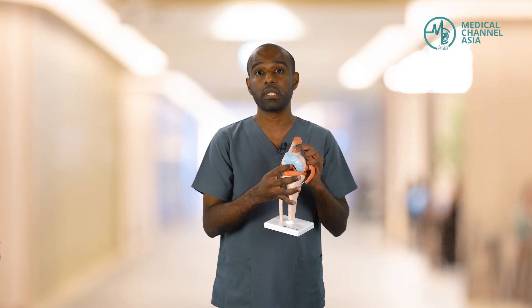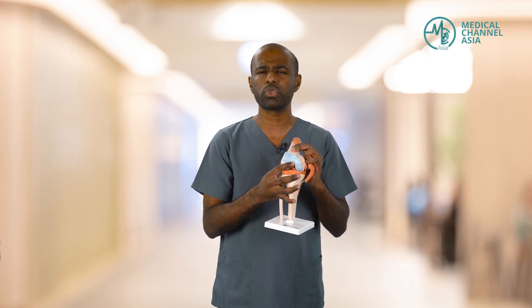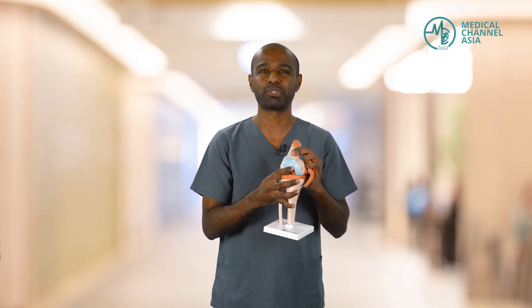Once all is done, the surgeon then decides what needs to be done for the knee. Whatever tissue is damaged, we will proceed to repair it and to restore the function of the knee as much as possible.